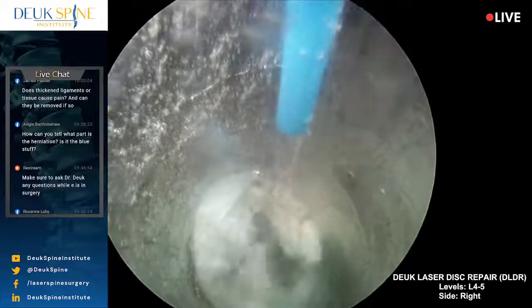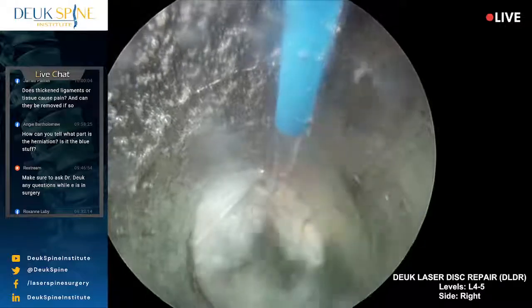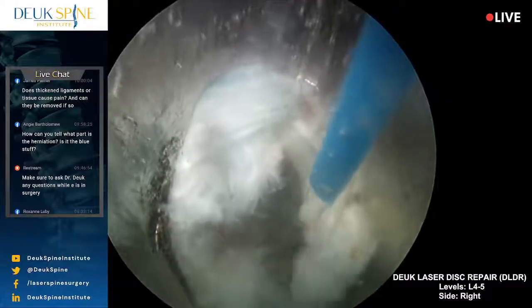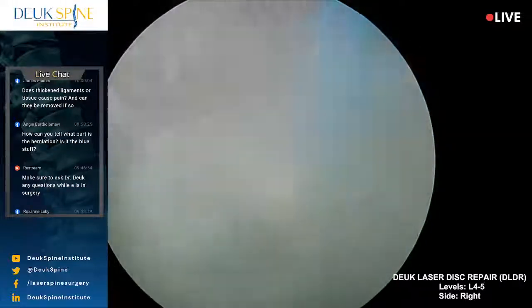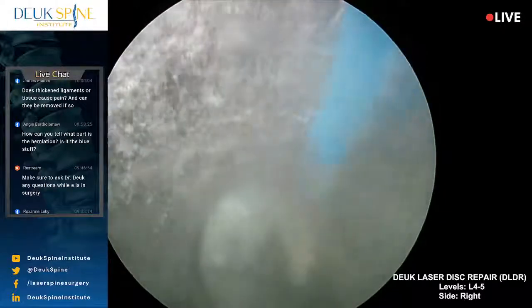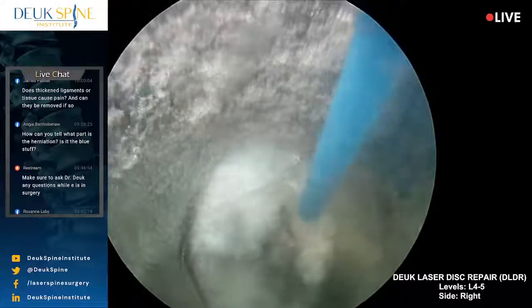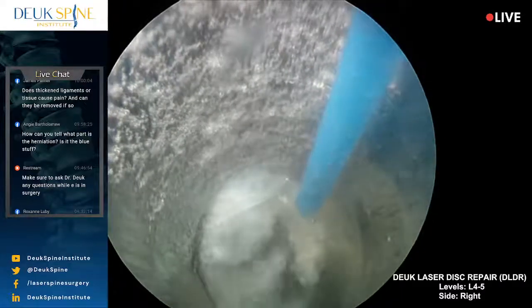Is the irrigation empty? All right. Well, I won't be Dick Major right now. Thank you. Do you have any more questions? Yes, we have a question from Facebook. We have no flow. Why don't we have flow? If there's air, it would be pushing air bubbles, and I don't see anything. All right, now I'm starting to see some flow.